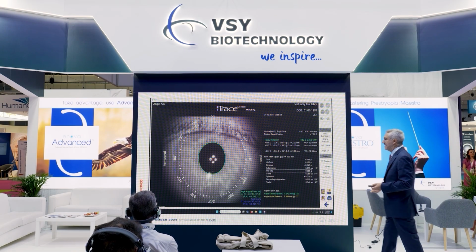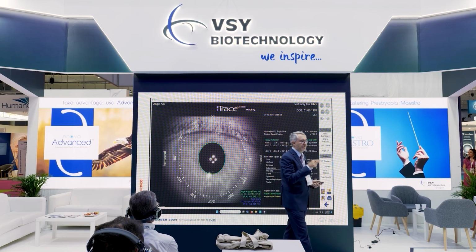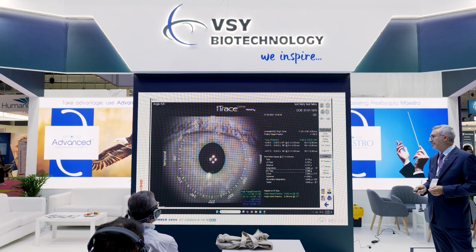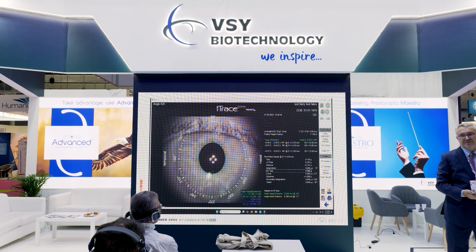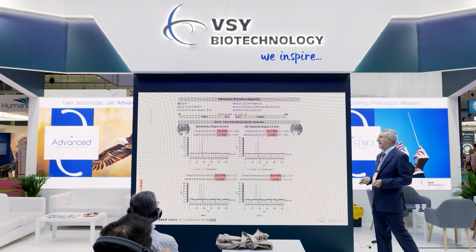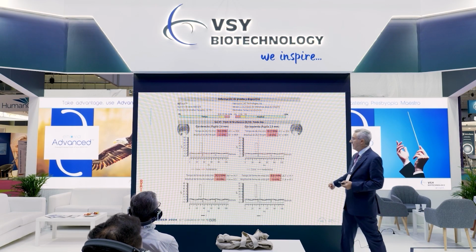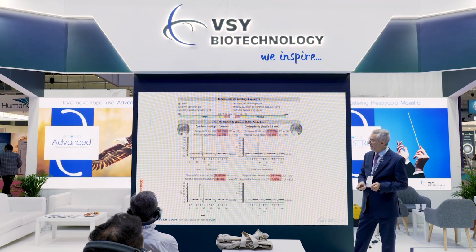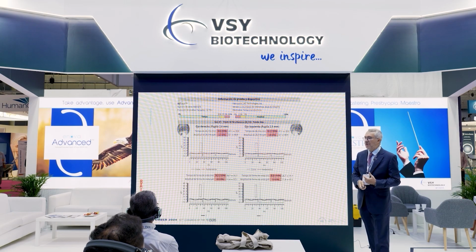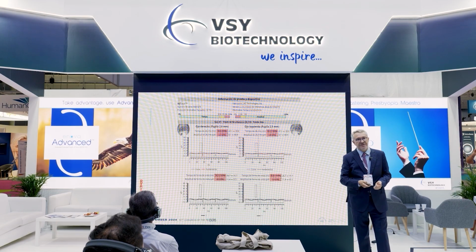Never forget the analysis we need to check, especially the pupillary area. We are very curious about diseases affecting the contraction of the pupillary area, because this lens has a superior performance and we might be opting for this type of implant. And finally, this is the result in an 85-year-old lady with age-related macular degeneration, dry form, in a steady condition, also with photobiomodulation treatments. She has very good vision with this lens.